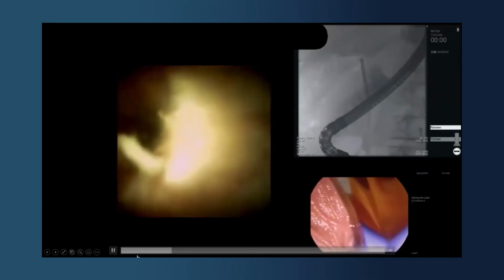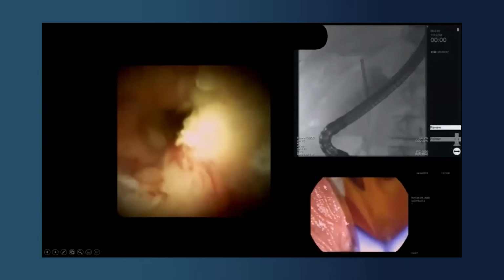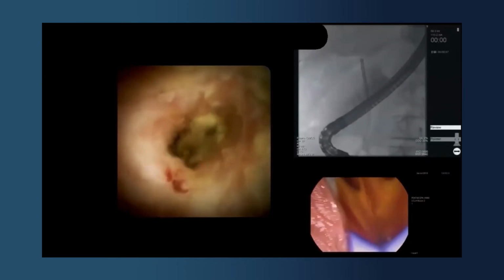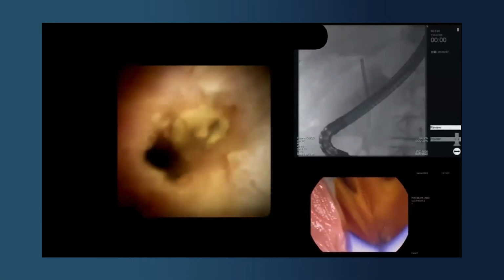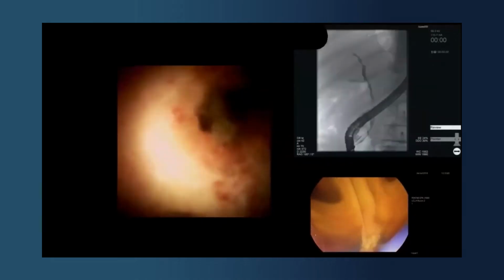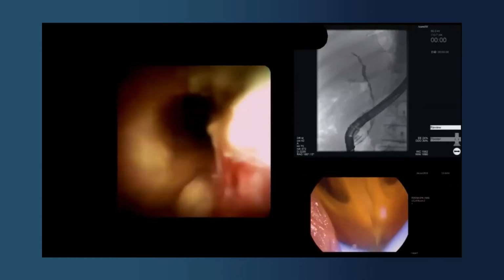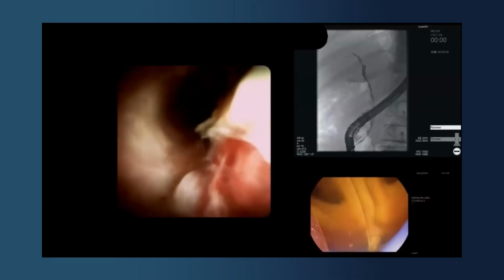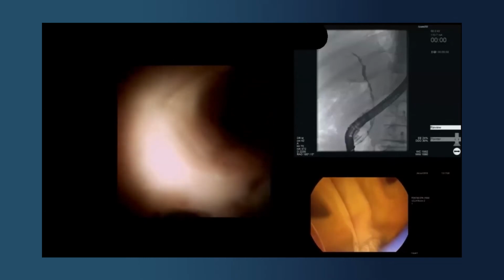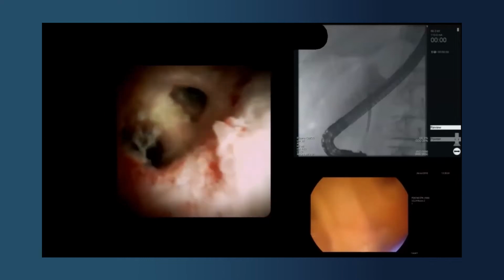You can see on cholangioscopy that there are areas of normal mucosa, top left, and abnormal nodular inflamed areas, easy contact bleeding, some new vessel formation. As we advance across the liver hilum, these areas persist. And there is an area of more papilliform type abnormality. No high-grade stricture, and in the intrahepatics there was diffuse cholangiopathy.